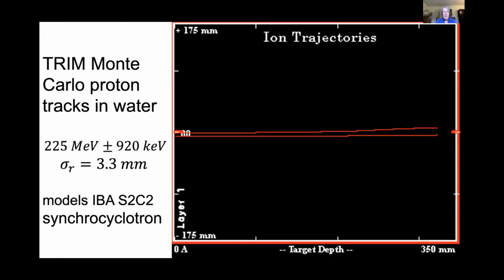But of course, during proton therapy, you don't just have one track, you have many. And so you can imagine, and I'm just showing you here a few ion tracks traced by TRIM, Monte Carlo software. If you've got 3 tracks, 4 tracks, 5 tracks, 9 tracks, you can see here that these particles don't enter at exactly the same place because they are charged particles. They repel each other a bit. It's hard to control them.